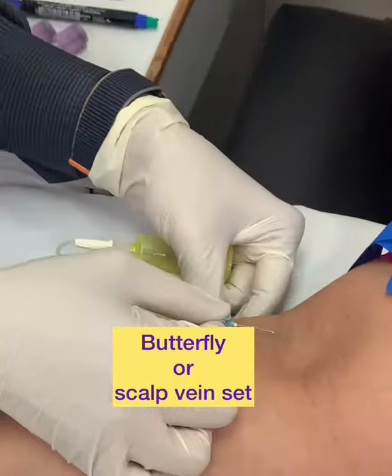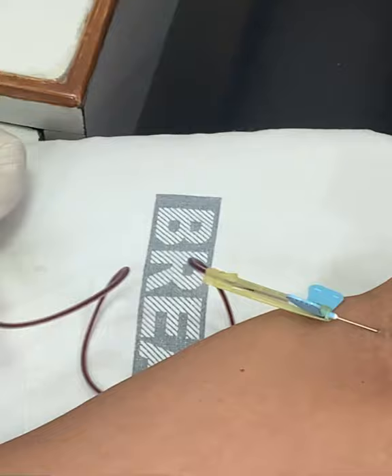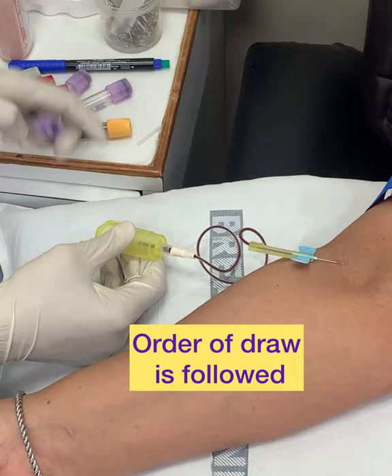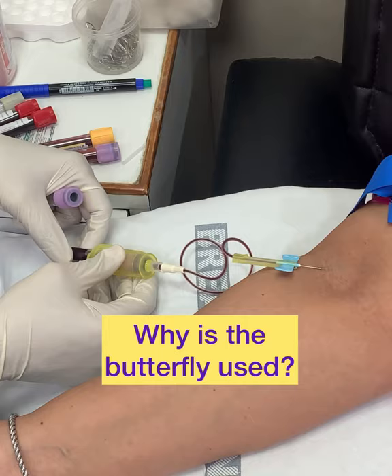Blood collection through the scalp vein set, or butterfly as it is called because it looks like one. You can see the blood is collected easily and the order of draw is followed during collection. The blood is generally collected by open collection or by closed collection. The butterfly system is used when the vein is very difficult to access, especially in obese patients.